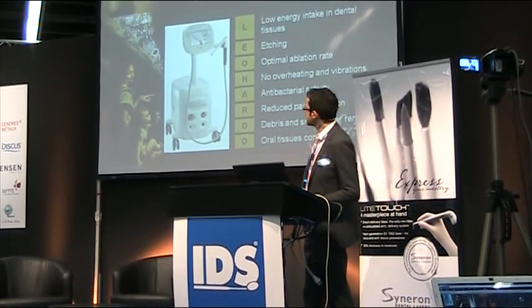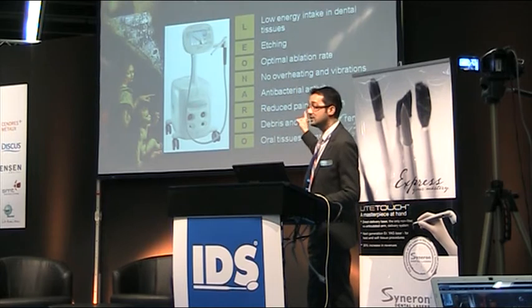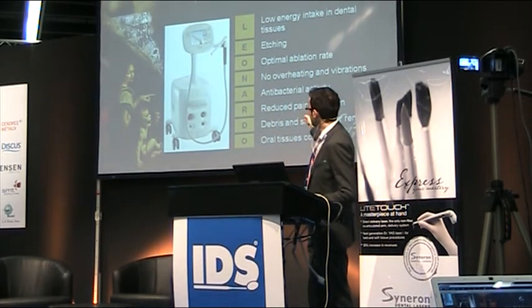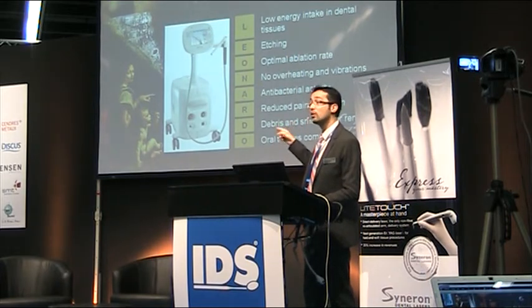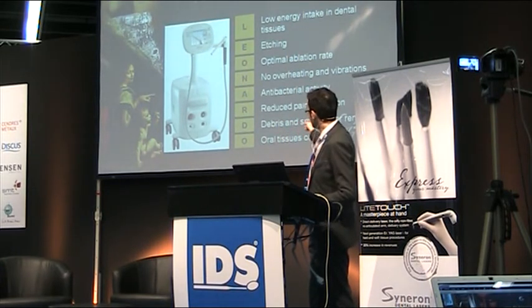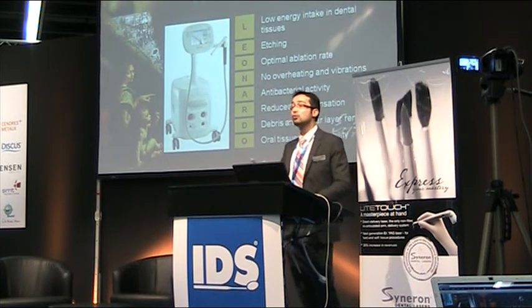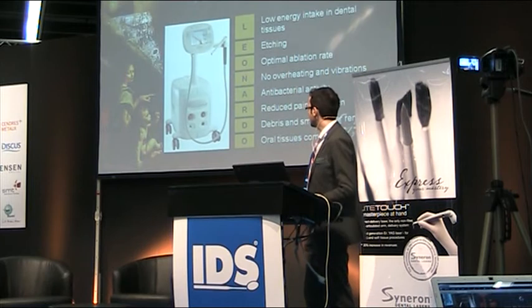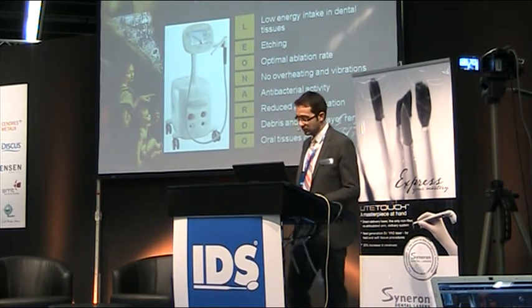The laser must possess antibacterial activity to avoid any additional medication for the cavity, to avoid the pain sensation, to remove the debris and not to produce the smear layer like the burs, and of course to be compatible with other oral tissue.